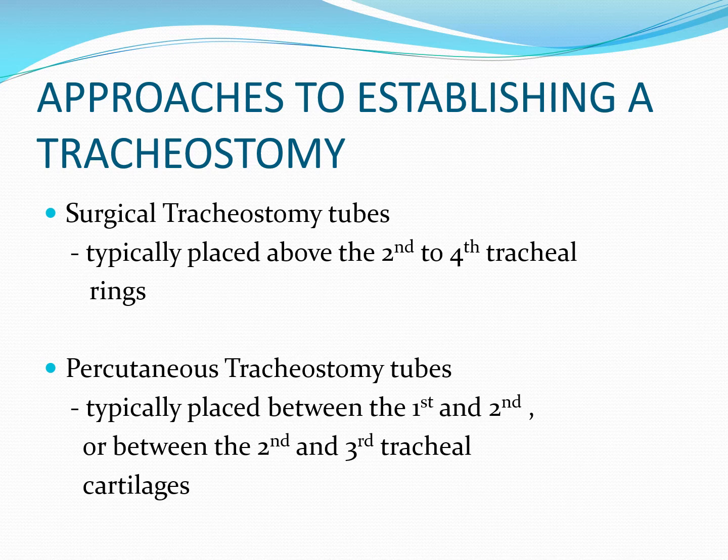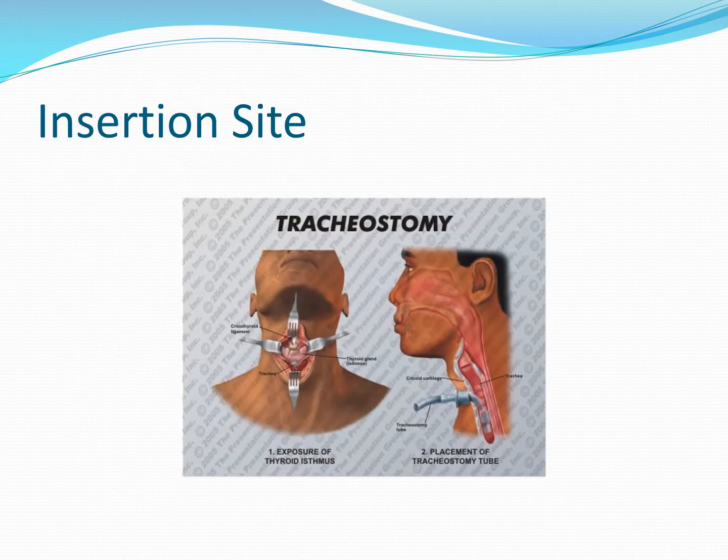Then progressively larger catheters are put in that stoma in order to dilate it to the point whereby, for an adult, a 6 or an 8 trach tube can be inserted in the patient. Much less common. The percutaneous dilation method accounts for a few percent of the cases. And as I said earlier, the surgical method is by far the vast majority of the cases.